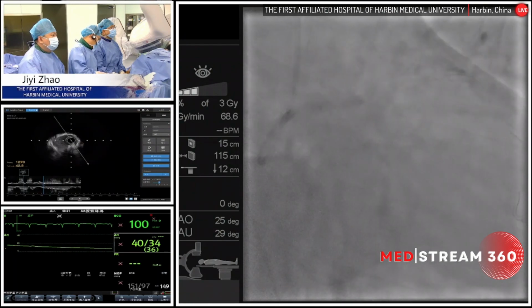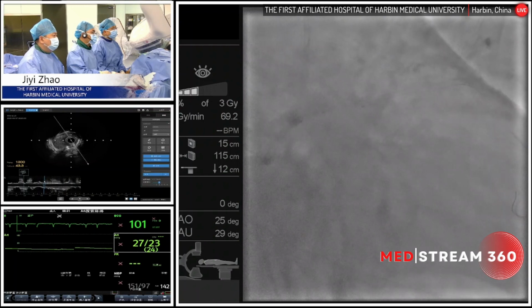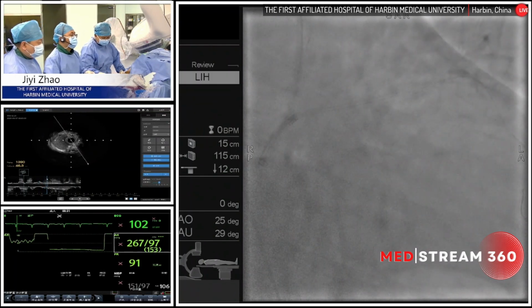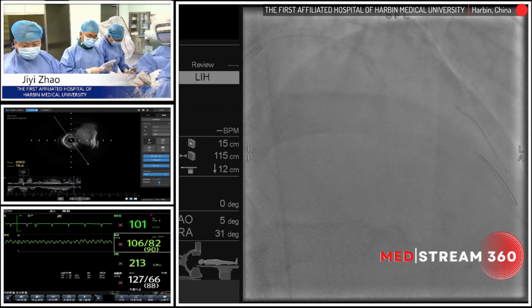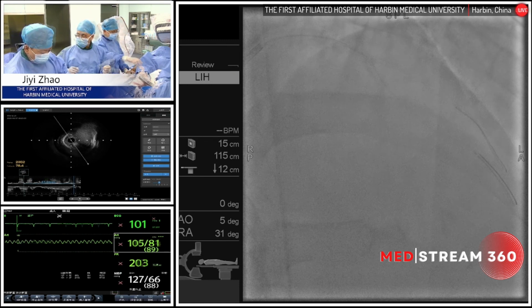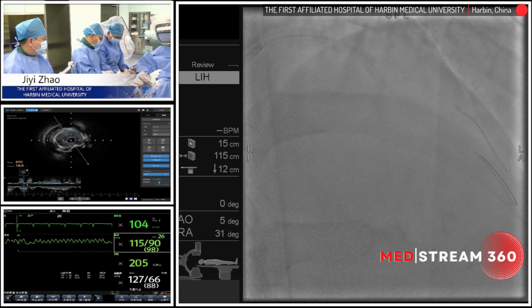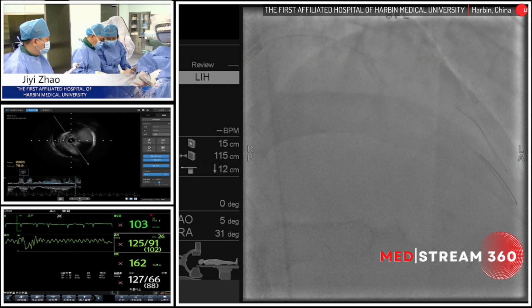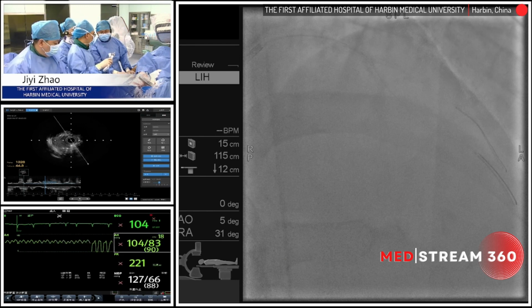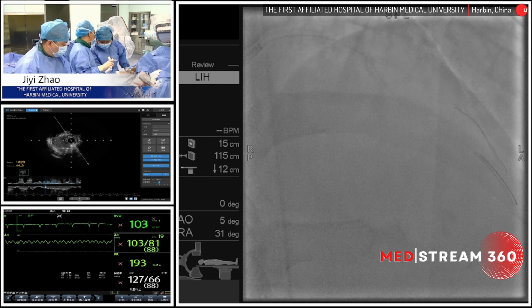And here is the proximal and also the distal and mid part of the LAD. I think after the second diagonal branch joins into the main vessel, we can also see some cracks later. For the peri-procedure, we measured the length as something like 60. I think this one is still the same. The first one is something like a 3 millimeter stent, and the proximal LAD, I think, is a 3.5. We need some further plaque modification. So yes, maybe we need to dilate the whole vessel very precisely before the stent implantation.